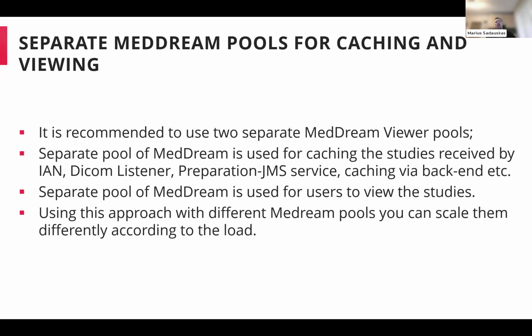So imagine that one set of MedDream viewers, a separate pool, is used only for caching the studies to prepare them in advance.